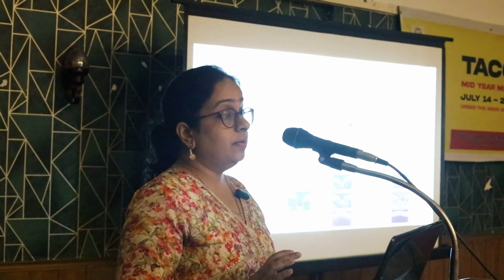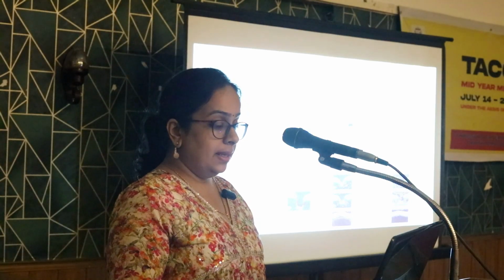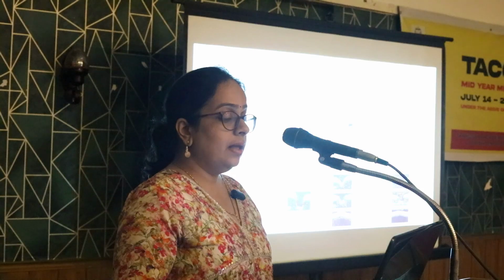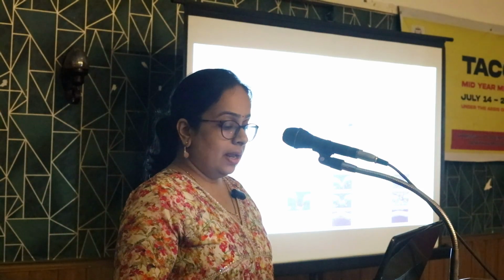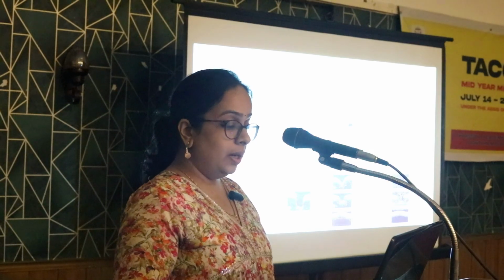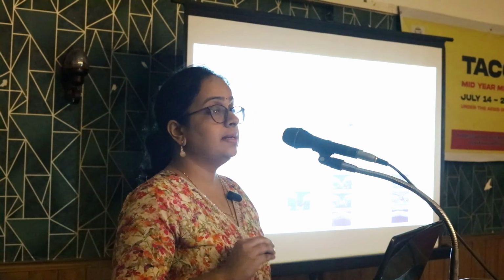OCT is an objective test. There can be segmentation errors and artifacts. Like in this case, the patient had a blink, and if this comes in the scanning area, you can have false positive results. Like there is a thinning noted in this clock hour, but it may be due to this artifact. So there can be some artifacts and segmentation errors.